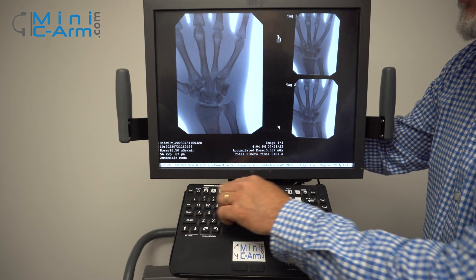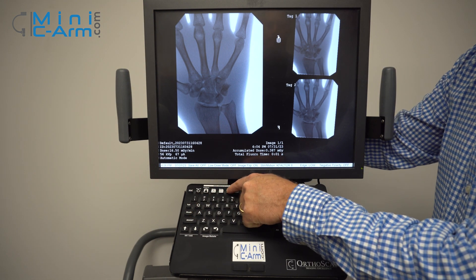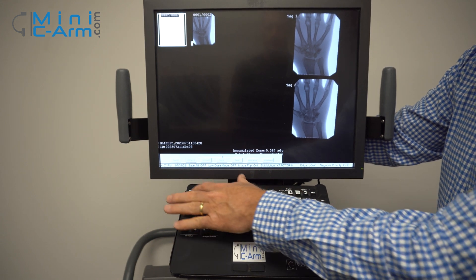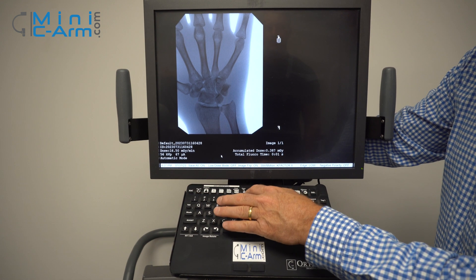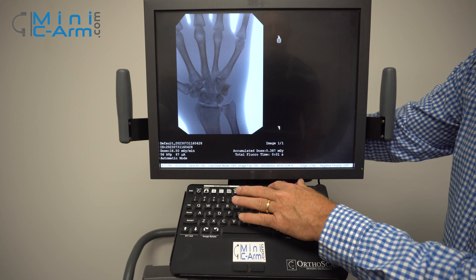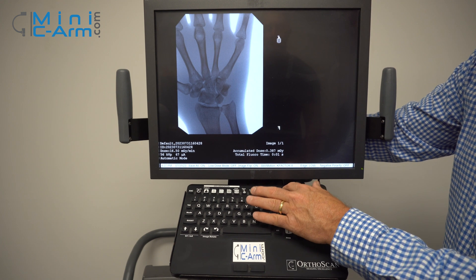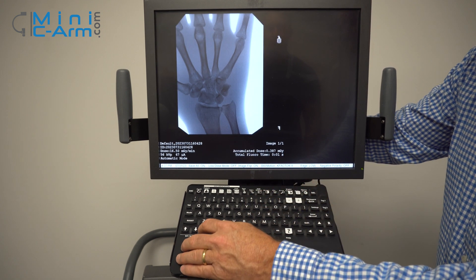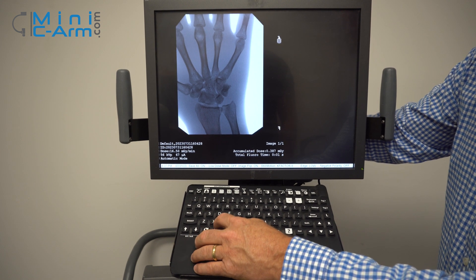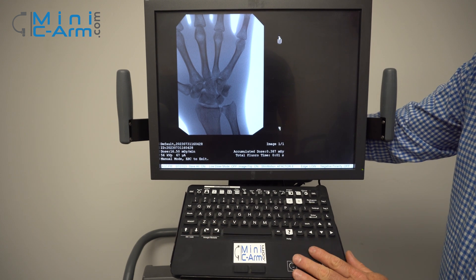All the keyboard functions are right up here at the top. You can do your cine record, press your case review button, press escape, save all, and do your still motion from here. You're in a gate. You can flip the image, zoom, and also rotate your image from these buttons.